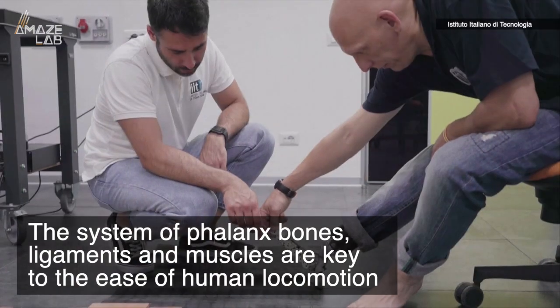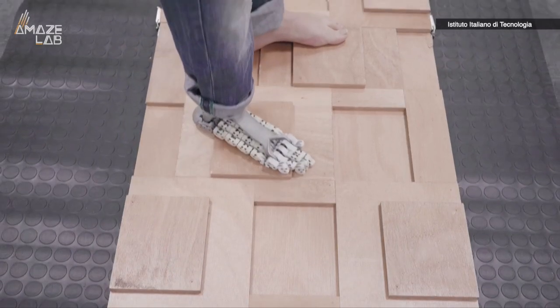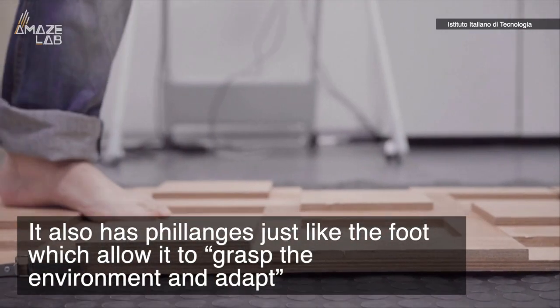This is one of Softfoot Pro's developers, Manuel Catalano. According to him, the system of phalanx bones, ligaments, and muscles are key to the ease of human locomotion. He adds that because of its soft body, it can absorb impacts well, but it also has phalanges just like the foot, which allow it to grasp the environment and adapt.